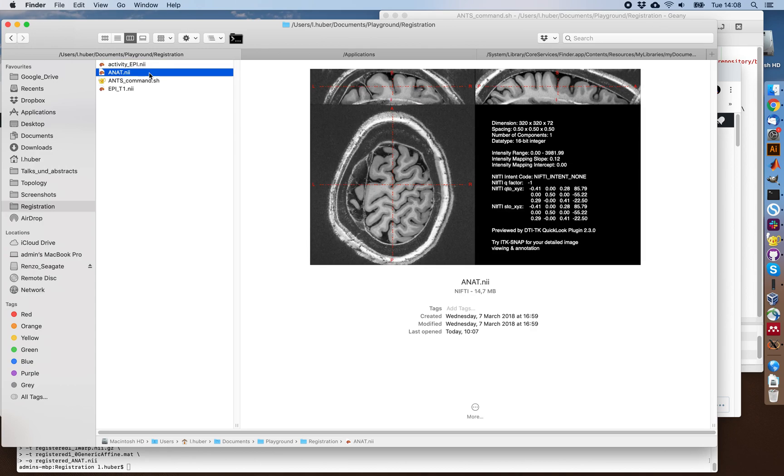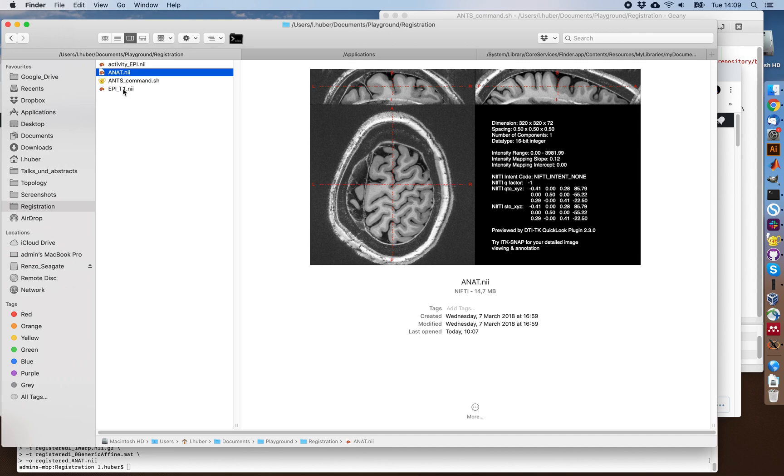So here I want to show you how I try to register the high resolution anatomical data to EPI space. And I do this with two different programs. One is ITK-SNAP and the other one is ANTs. And I will show you why.